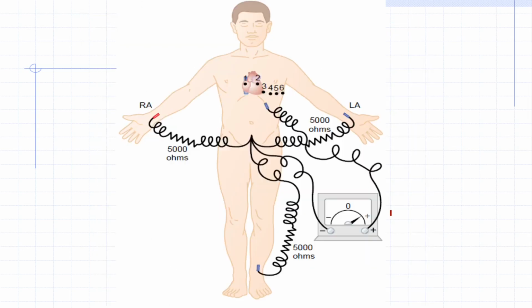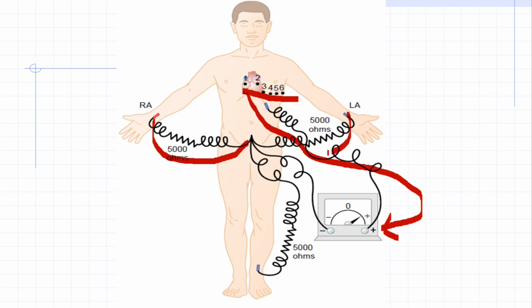So this is the placement of electrodes in the chest leads, precordial leads. At these 6 points, one active electrode is kept. This is the active electrode that will be kept on V1 to V6 point, and this will be going down to the positive terminal of the ECG machine, while another one is indifferent electrode which is coming from all these three limbs. Then it will pass through the electrical resistance and it is going down and connected to the negative terminal of the ECG machine.